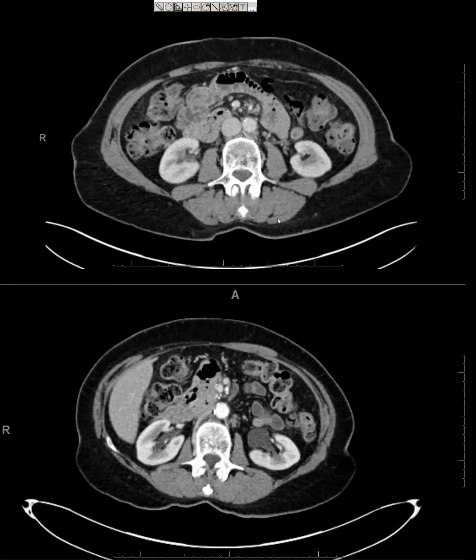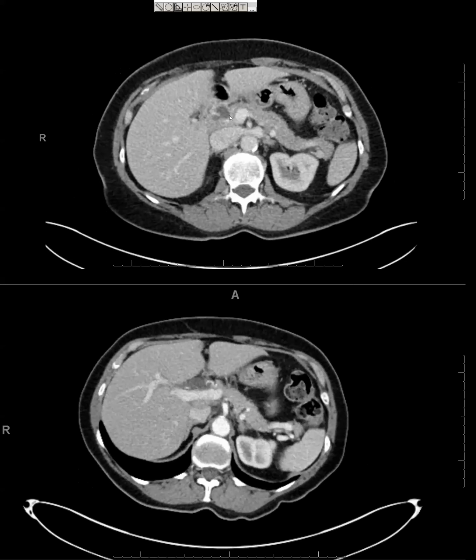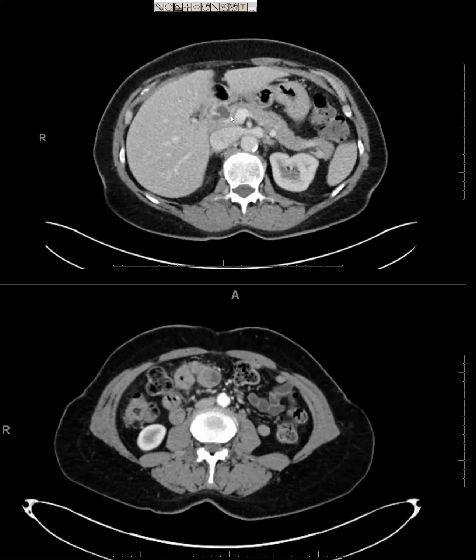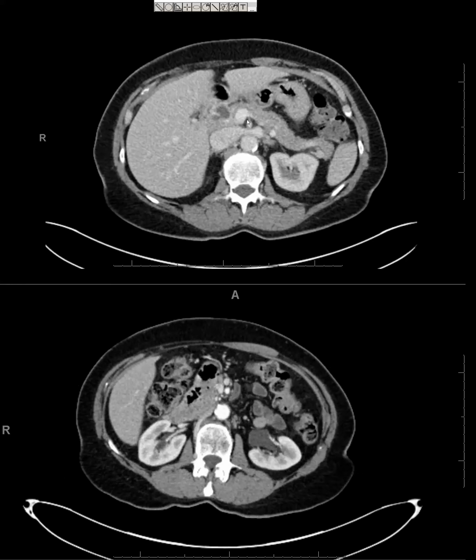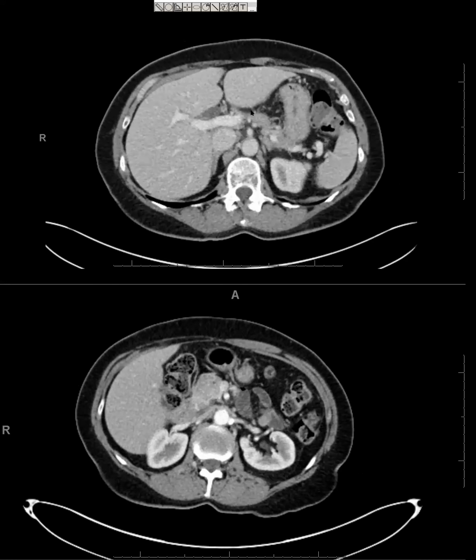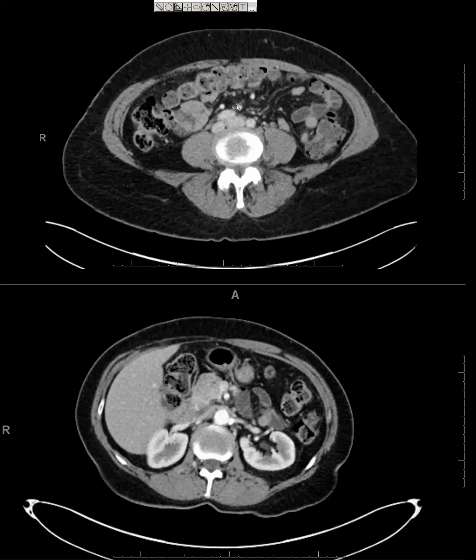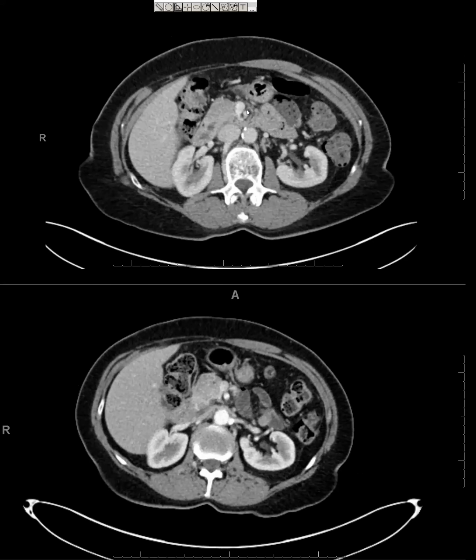So this is the first time I've ever seen it, and I have seen from time to time adults that are malrotated, and there have been some interesting cases over the years. I'd never seen one where it looked like it spontaneously went back to a normal anatomic position. And again, we sort of speculated as to whether or not this may or may not be related to the patient's long-standing symptoms. If it was felt warranted, I suppose a surgeon could go in there and try to correct the anatomy and tack things down.